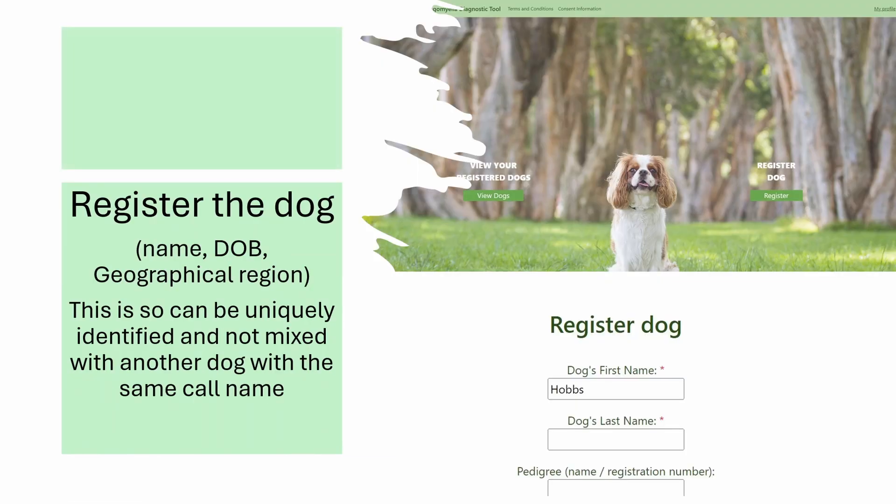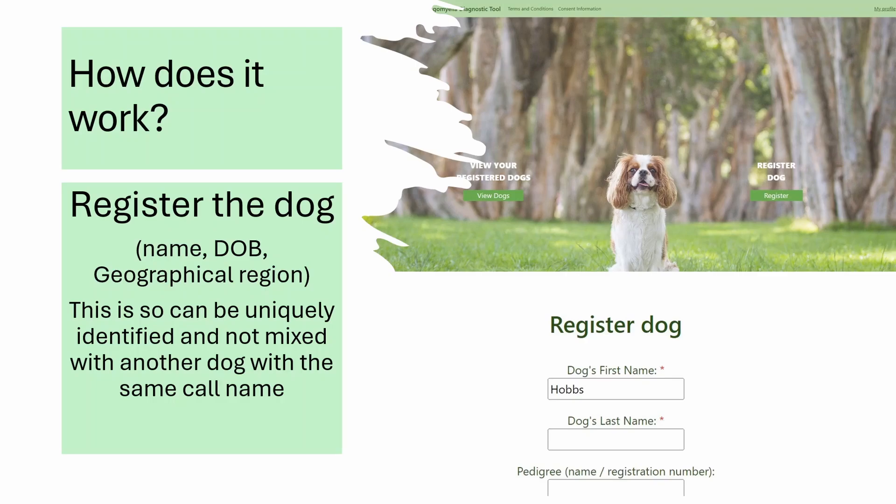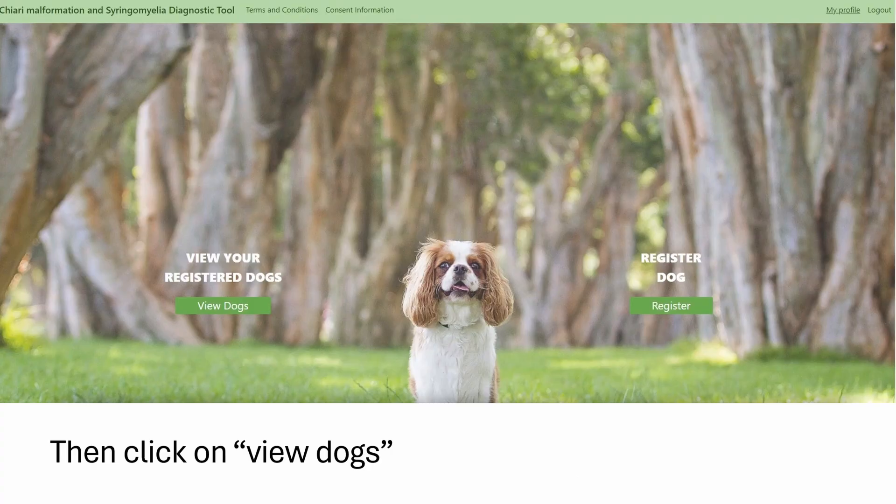When you register a new dog, you put in the dog's name, their date of birth, and their geographical region. This is simply so that the dog can be identified in the database and not mixed up with another dog with the same call name — for example, Charlie is a very common name for a Cavalier King Charles Spaniel. Some details are necessary; others are optional, like the dog's pedigree name or registration number.